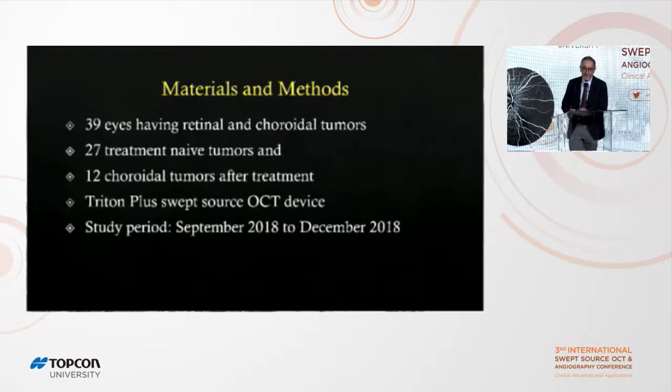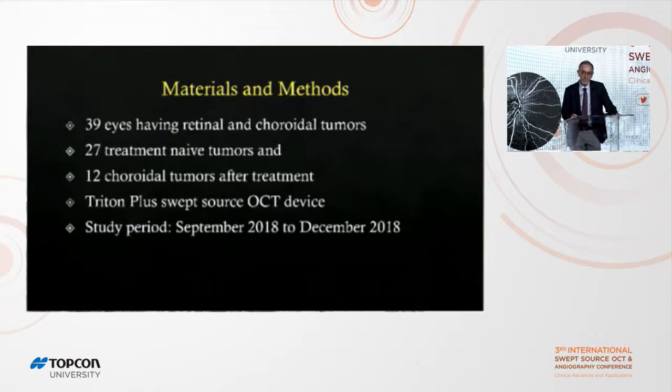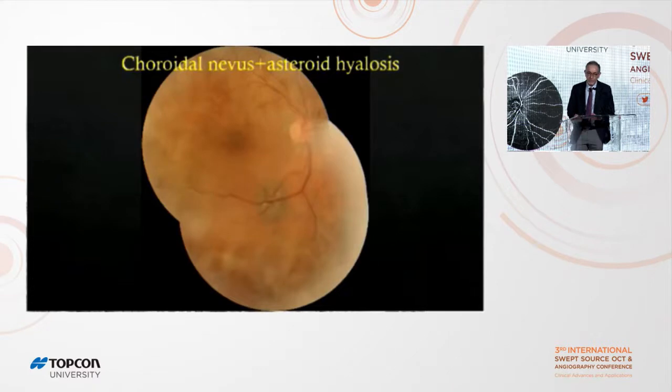So I studied 39 eyes having retinal and choroidal tumors. 27 patients had treatment-naive tumors and 12 had choroidal tumors after treatment. And all the studies were performed using the Triton Plus swept source OCT device. I would like to show you some examples now.